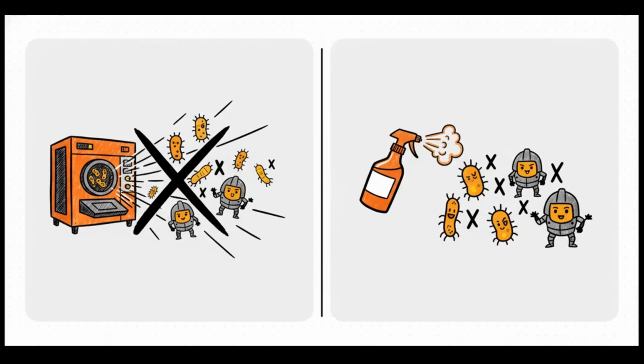Okay, so if you only remember one thing from this first section, let it be this. The single most important dividing line between sterilization and disinfection is the ability to kill bacterial spores. Sterilization does, disinfection does not. That is the money answer for your exams and for safe practice every single day.